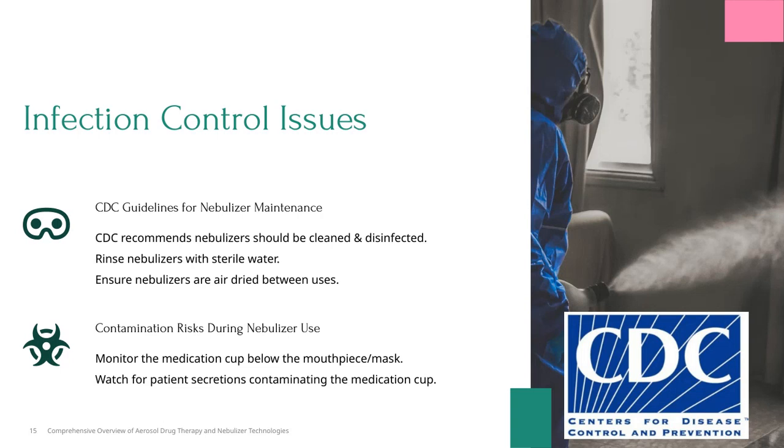Now, let's discuss contamination risks during nebulizer use. It's important to monitor the medication cup located below the mouthpiece or mask. Keep an eye on it to ensure it remains clean and uncontaminated. Watch especially for any secretions from the patient that might contaminate the medication cup, as this could increase the risk of infection. Moving on to CDC guidelines for nebulizer maintenance.